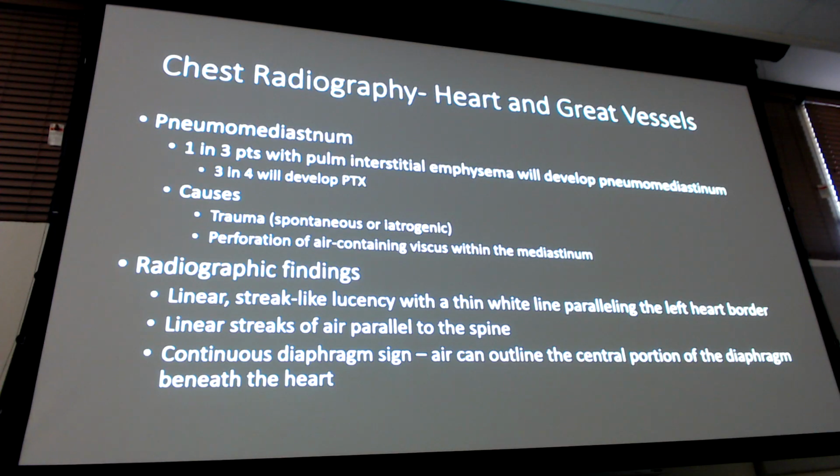Yes, you can have fluid and air depending on the mechanism of injury. Lung markings, right? Absence of lung markings. I think that's a pretty down and dirty review of pneumothoraces. Remember what your EFAST looks like, right? You've got beach, ocean, sky. You're relaxed. You're not worried about it. Sipping a Mai Tai, chilling because the patient doesn't have a pneumothorax. Barcode sign. Oh crap! Right? They have a pneumothorax.